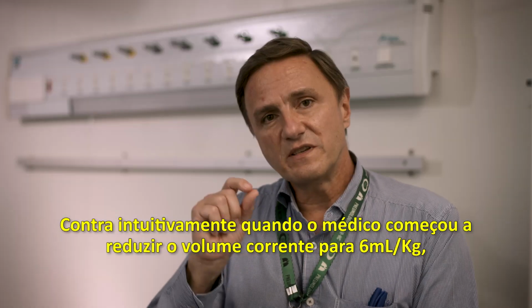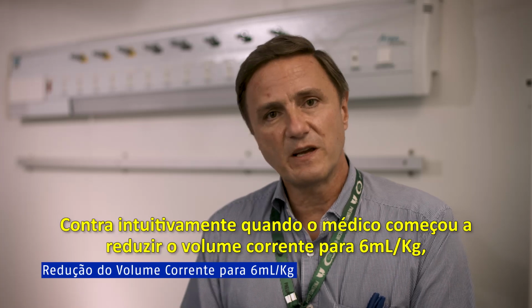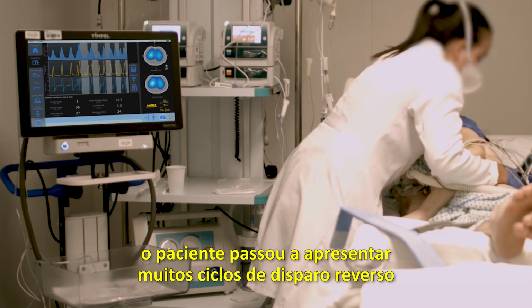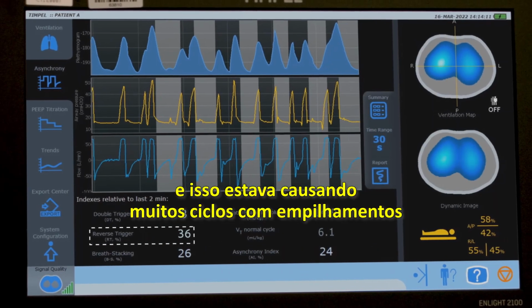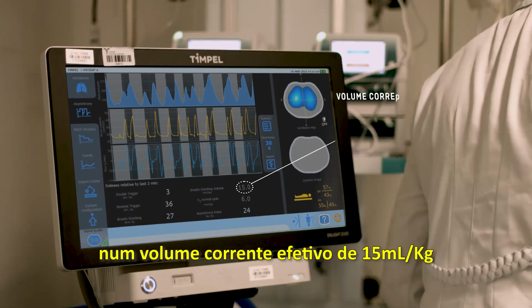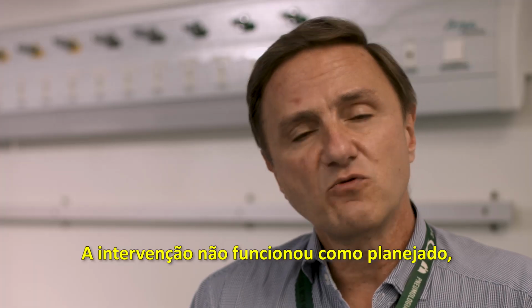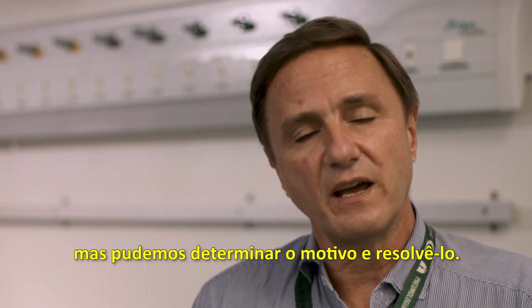Counterintuitively, when the physician started to decrease the tidal volume to 6 mL per kilogram, and the physician didn't realize this, the patient started to present many cycles with reverse triggering, and this reverse triggering was causing many cycles with breath stacking with an effective tidal volume of 15 mL per kilogram. The intervention didn't work as planned, and we could determine the reason and solve it.